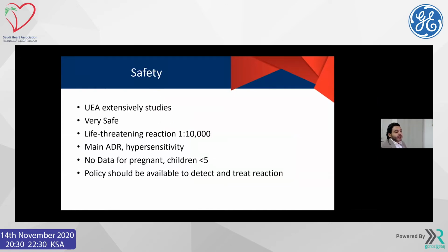Action, it is less than 1 in 10,000. And the main adverse reaction we are worried about is hypersensitivity. We don't have any data for pregnant patients or children below the age of 5. Policy should be available in all the centers using contrast about how to react if you have an adverse reaction.